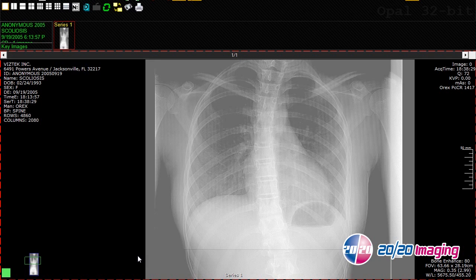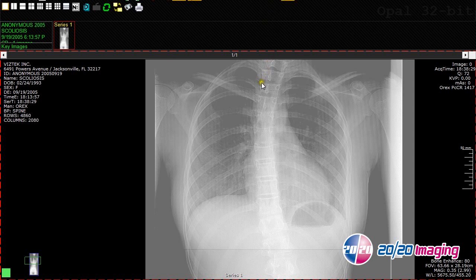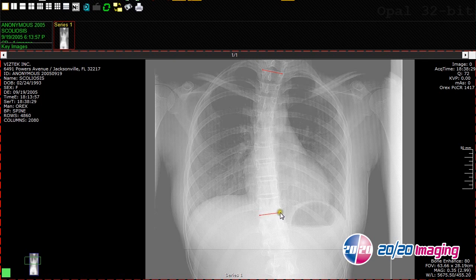The Cobbs angle tool allows us to measure the angle of a scoliosis in a given region of a patient's spine. To draw a Cobbs angle, click on the Cobbs angle tool on the main toolbar. Then click on the left aspect of the superior endplate of the most superior vertebra that contributes to the scoliosis, then click on the right aspect of that same endplate. Cobbs angle is automatically displayed on the image, and you can move the angle to the exact point where you would like to place it.